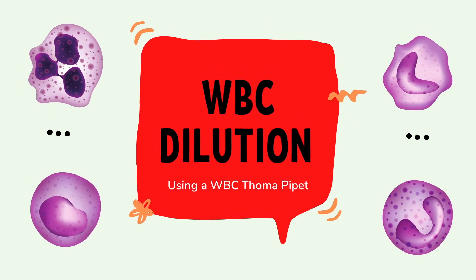Good day everyone! This video will demonstrate how to perform a WBC dilution using a Thoma pipette.